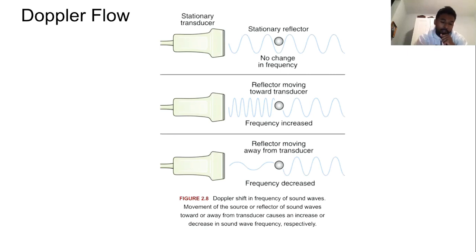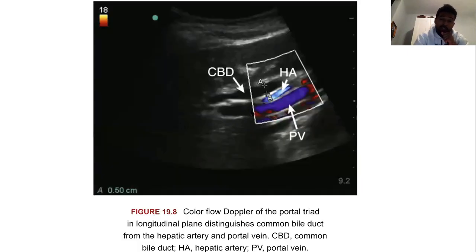And the best way you can do that, for deep vessels like this, it's hard because now everything is parallel. You can kind of try to tilt the transducer a little bit, get like 10 degrees of angle on it, on the soft tissue on top of it. That way you get some of the Doppler effect, but you can't really. But on the portal vein, I think there's an example.